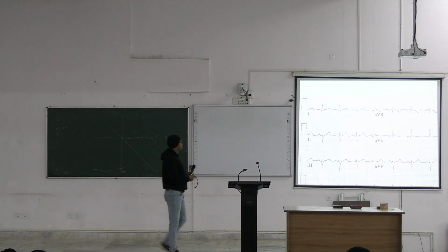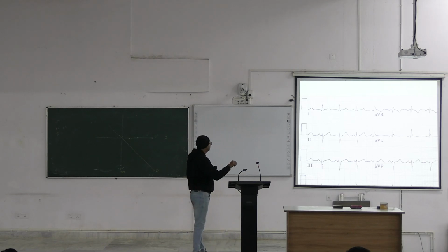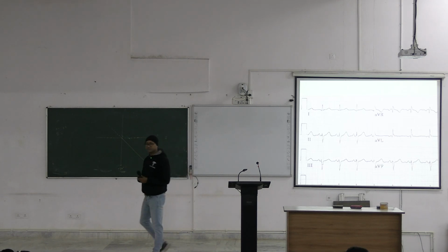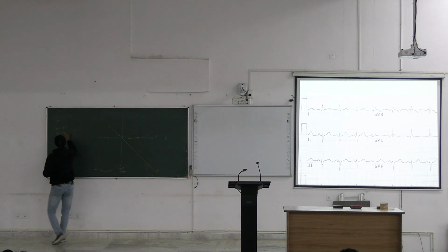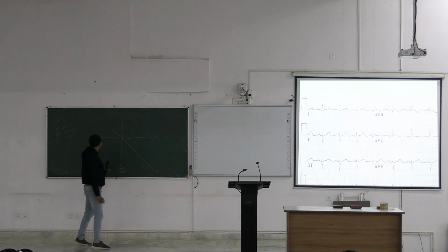So it is something plus, something minus, right? So plus is plus 3 we can consider, and down is 1, 2, 3, 4, 5, 6, right? Okay. So plus 3 minus 6, it is coming to minus 3. Okay. So lead 2 minus 3.